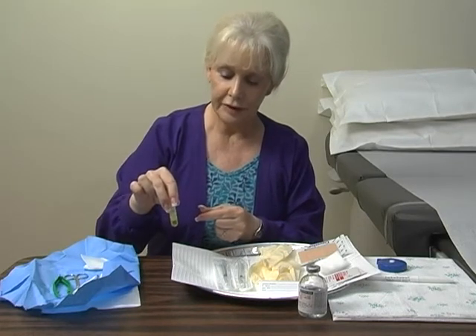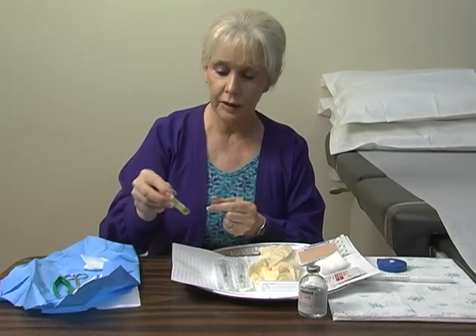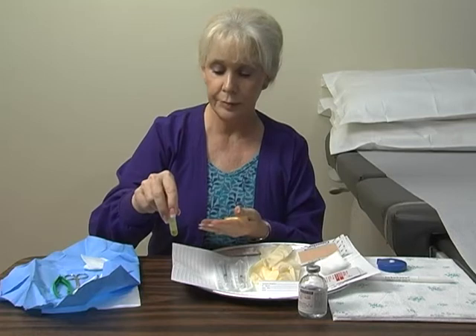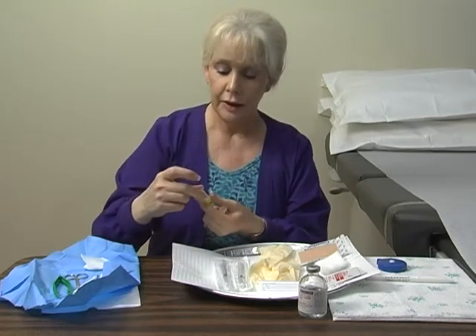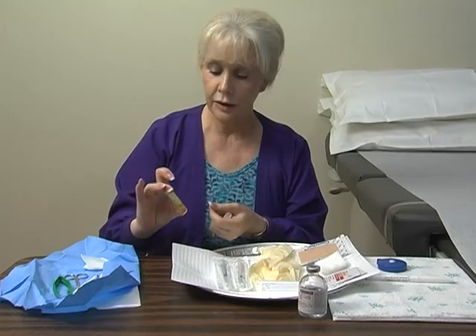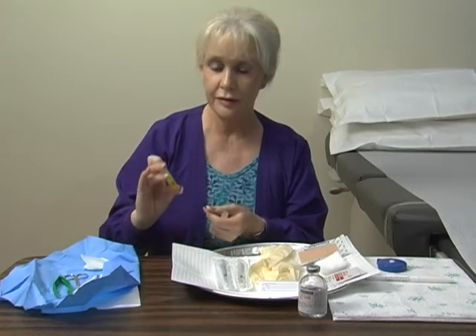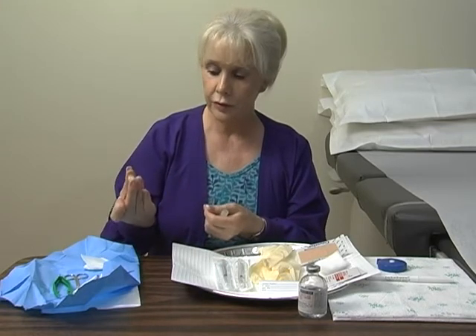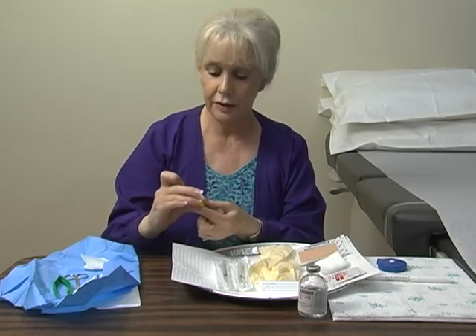Once the specimen is placed within the tube, gently rotate it one or two times so that it is coated with the Zamboni. You'll notice that it will float to the bottom of the tube. These do not need to be refrigerated — they are kept at room temperature, and the specimen will be mailed back to us at room temperature. So there's no refrigerating, no packing in ice, and there is no expiration date on these.